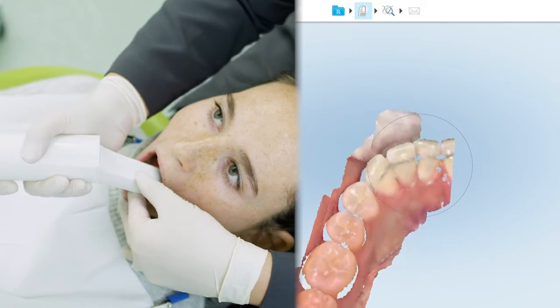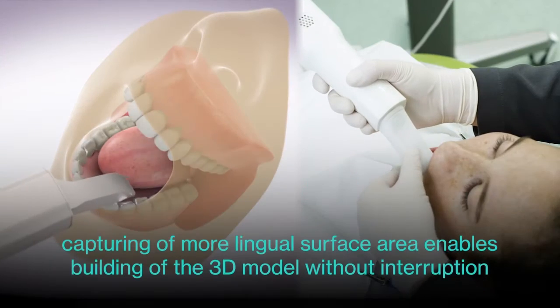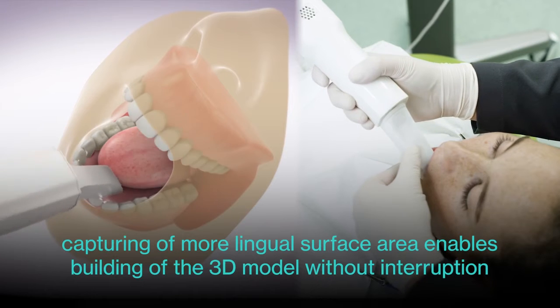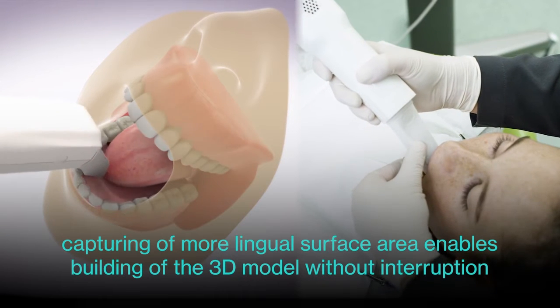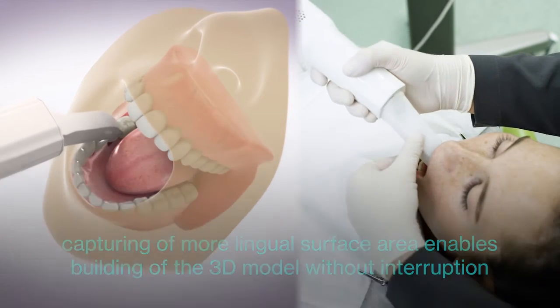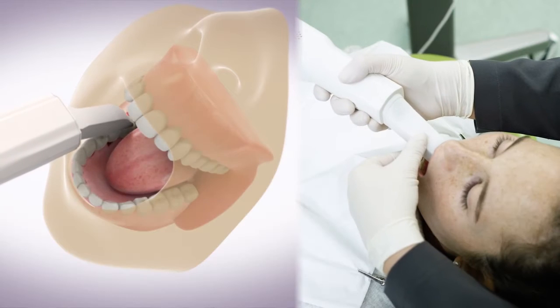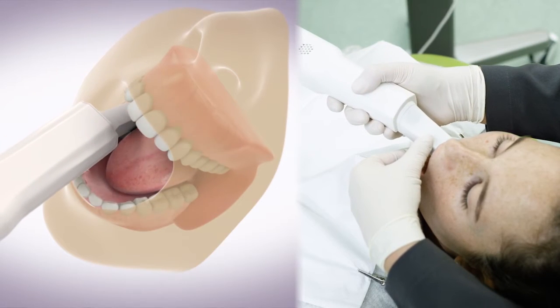When you reach the bicuspid, continue across the anterior, tilting slightly to the lingual, and at the contralateral bicuspid proceed by moving the tip straight back to the opposing terminal molar.